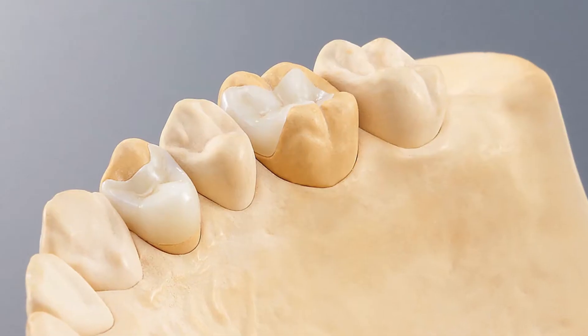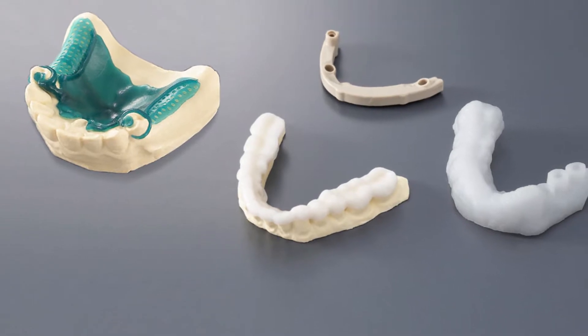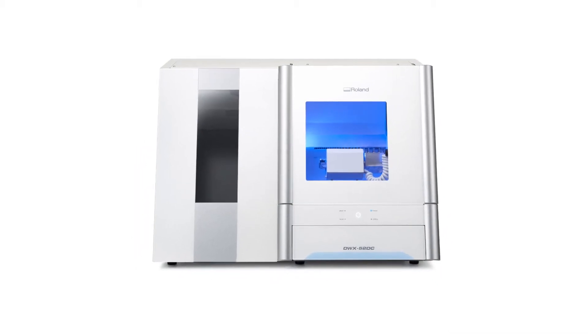To produce the highest quality crowns, bridges, inlays and onlays, copings, abutments, and other dental restorations, this is the ideal milling device.